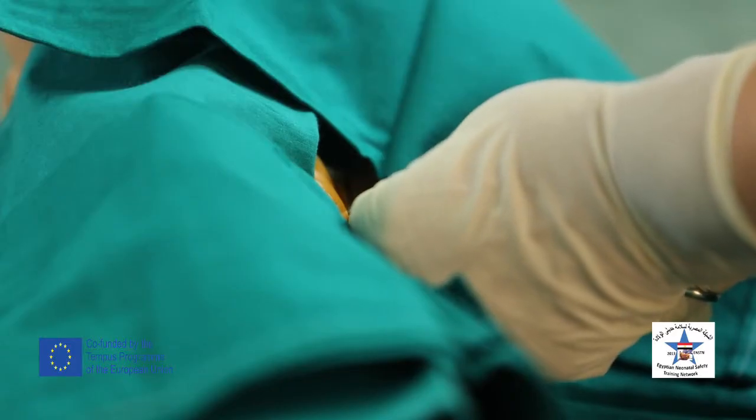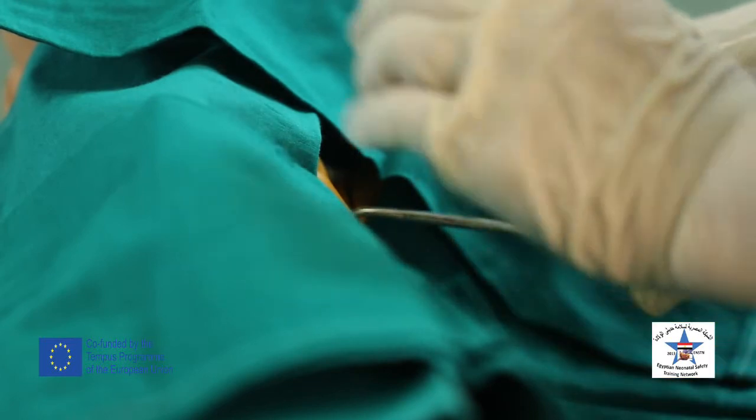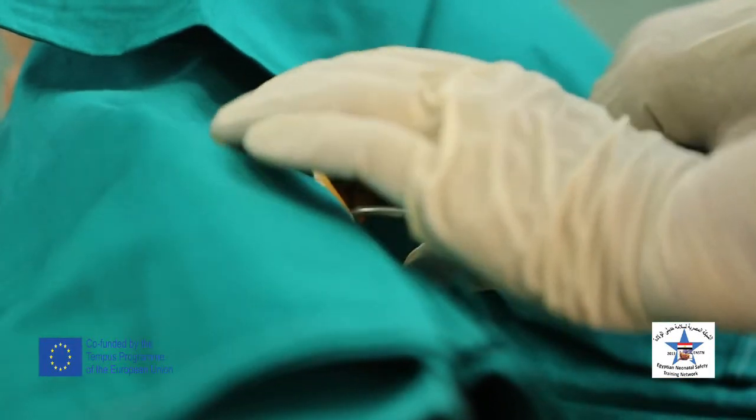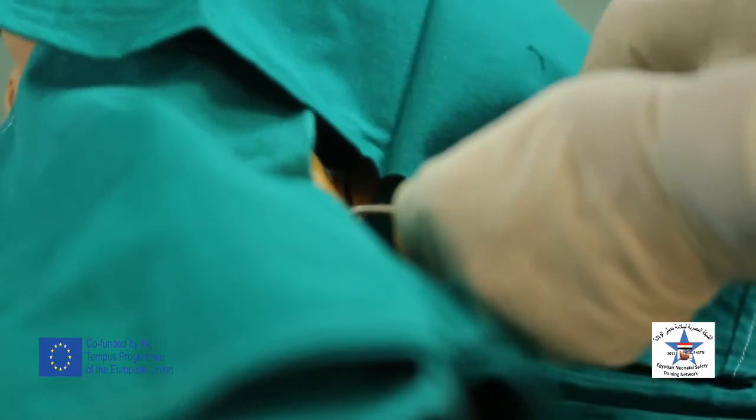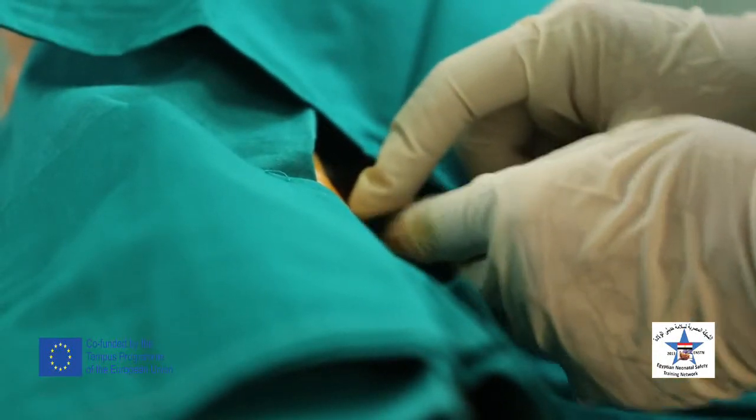I will close my curved forceps and push forward through the pleura, guided with my finger until it gives way.